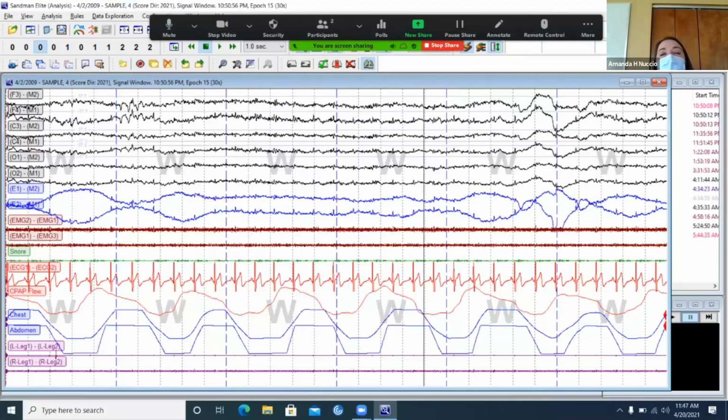Okay, so your high frequency filter sets the upper limit of what we're looking at. It's also known as your low pass filter. Essentially any frequencies above it are blocked and every frequency below it is allowed to pass. So it creates that upper limit. Your low frequency filter is also known as your high pass filter. It sets the lower limit for what frequencies are allowed to pass. Everything above it can pass, everything below it gets blocked.